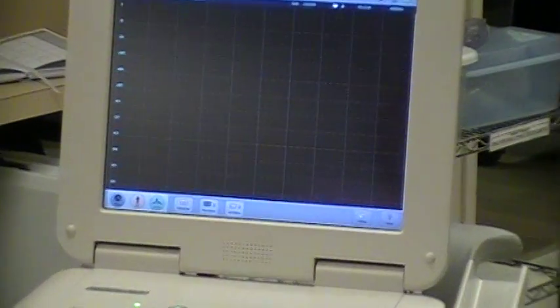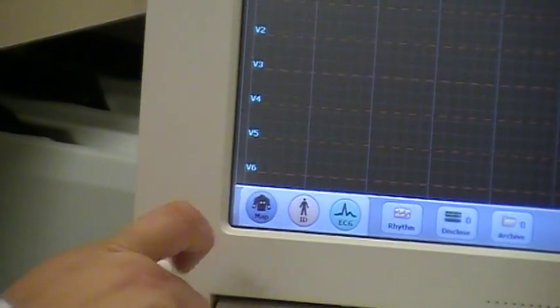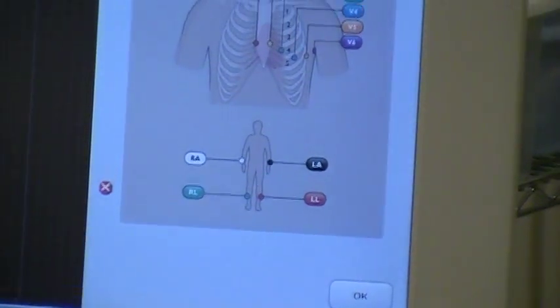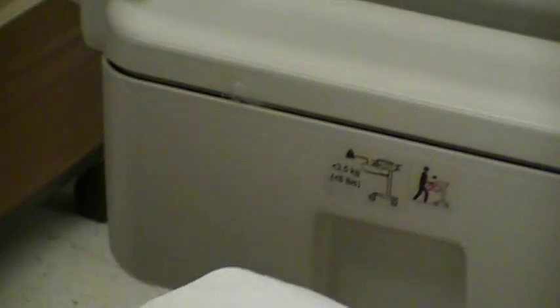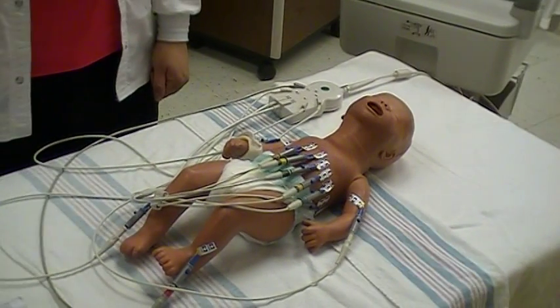After placing patient information in the EKG machine, you can pull up your patient map. This is a guide to EKG lead placement on the chest. The right arm and the left arm leads should mirror each other on the limbs and should not be placed over bony prominences. The leg leads also should mirror each other and not be placed over bony prominences.